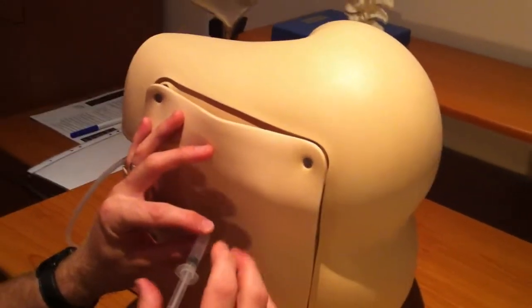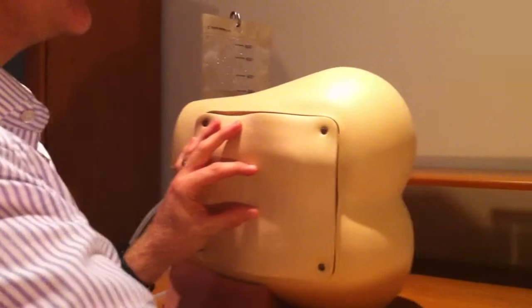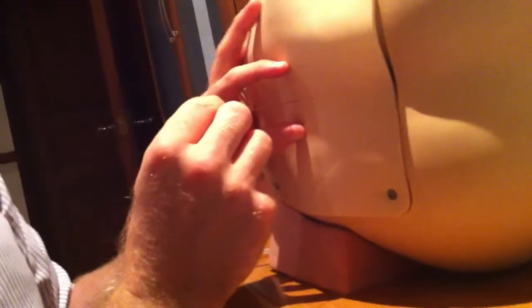When you've put in about maybe two mls in total you get a small hole in the skin and that's a small hole through which your atraumatic needle will pass.